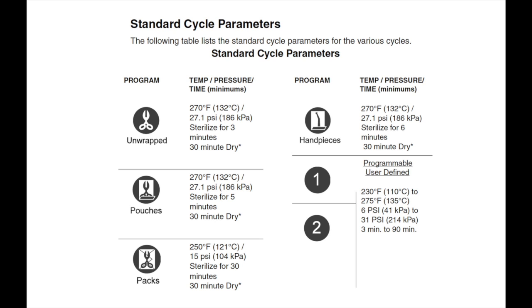Your autoclave has four pre-programmed cycles and two programmable cycles. The program cycles include unwrapped, pouches, packs, and handpieces. Cycle parameters can be found in the installation and operations manual.